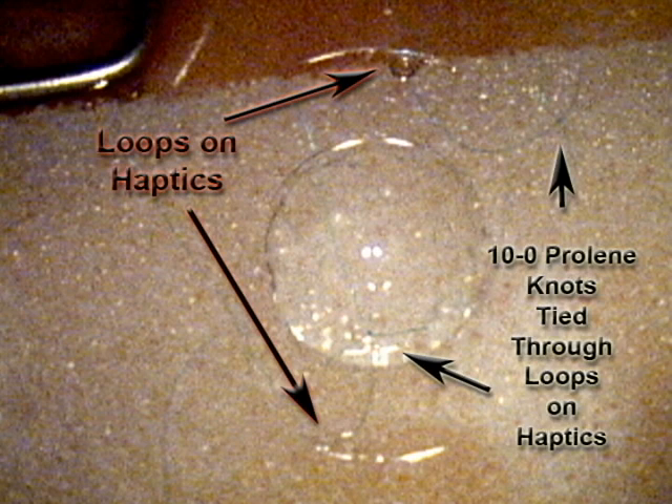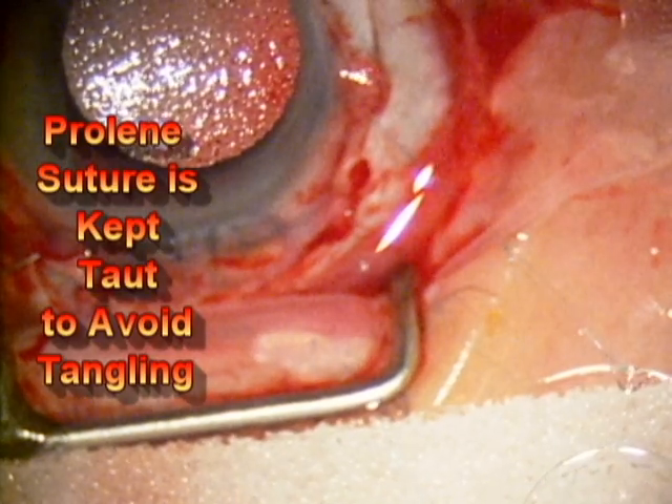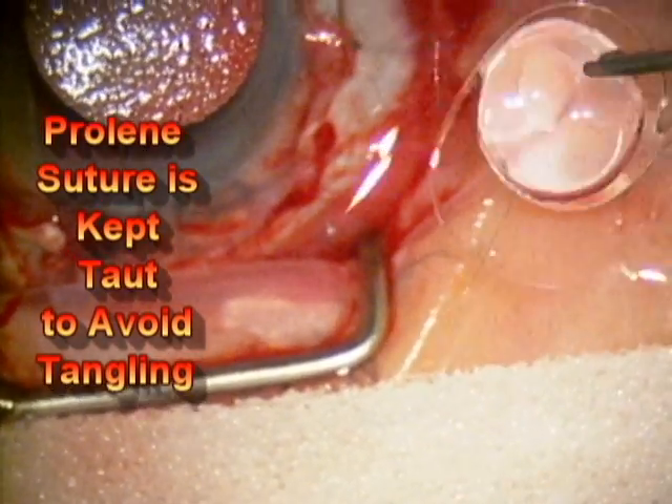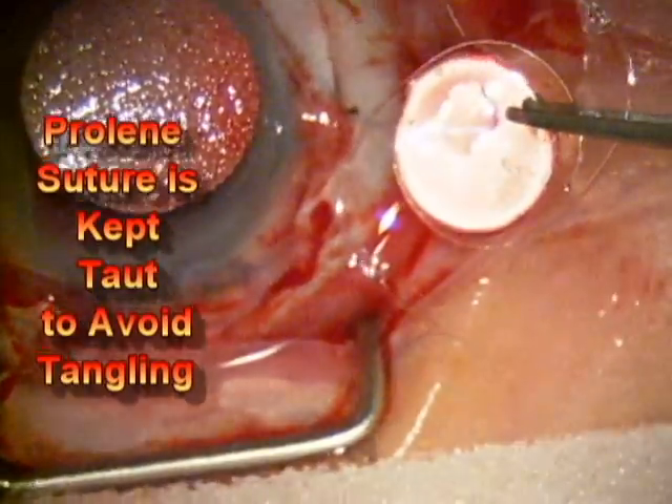This is a special posterior chamber intraocular lens that has loops on the haptics. The prolene sutures are tied through those loops and that helps the intraocular lens to remain stable inside of the eye in the proper position.